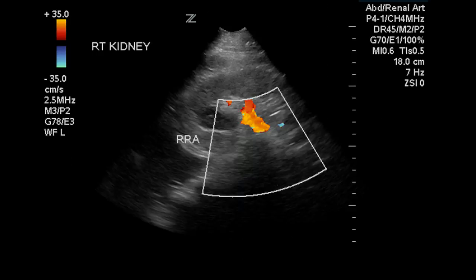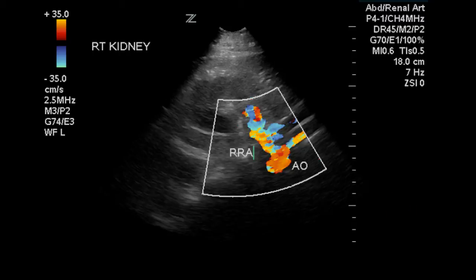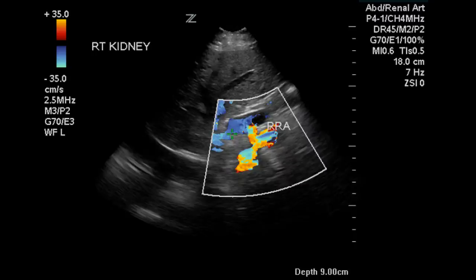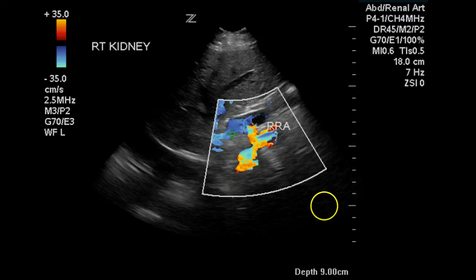This is a nice image of the right renal artery in the distal third, and it fills nicely with color. Here we see the entire length of the right renal artery to the aorta. This is the origin of the right renal artery, and we have a peak systolic velocity of 68.5 centimeters per second. All of the measurements of peak systolic velocity of the renal artery were less than 180 centimeters per second. Another image of the right renal artery origin — we can see it as it passes underneath the vena cava.